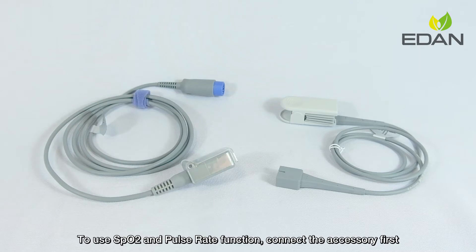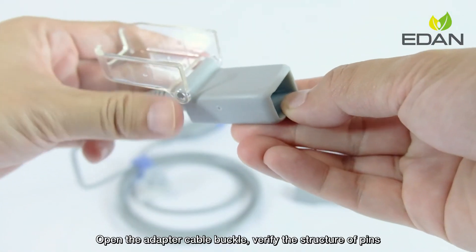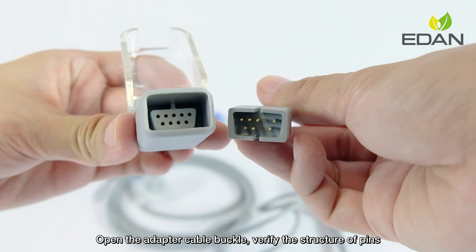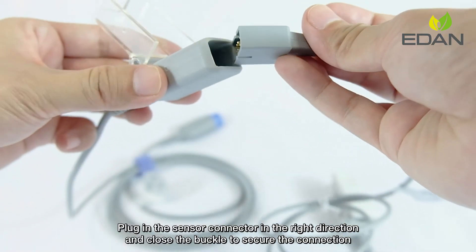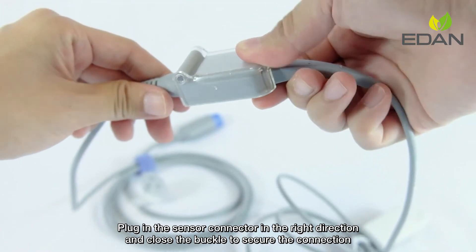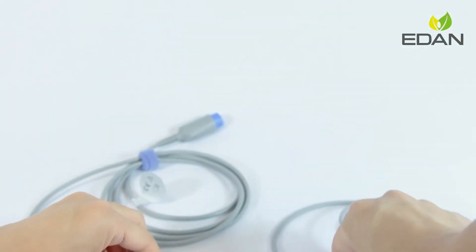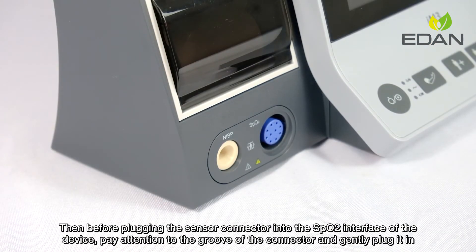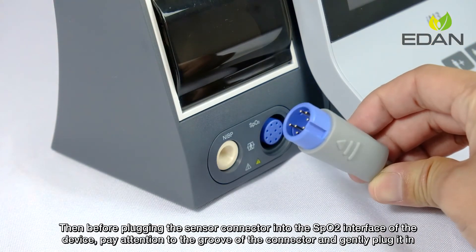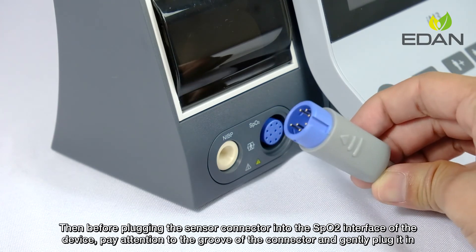To use the SpO2 and pulse rate function, connect the accessory first. Open the adapter cable buckle and verify the structure of the pins. Plug in the sensor connector in the right direction, and close the buckle to secure the connection. Before plugging the sensor connector into the SpO2 interface of the device, pay attention to the groove of the connector and gently plug it in.